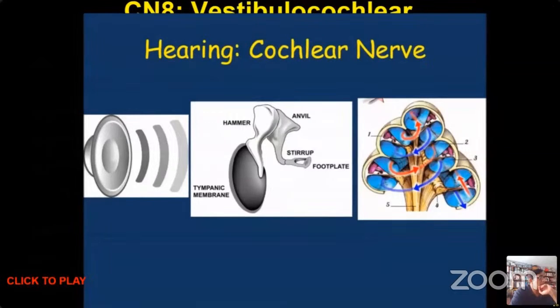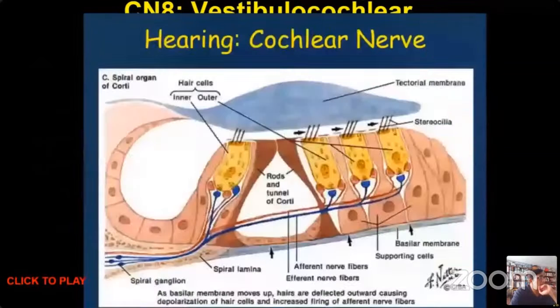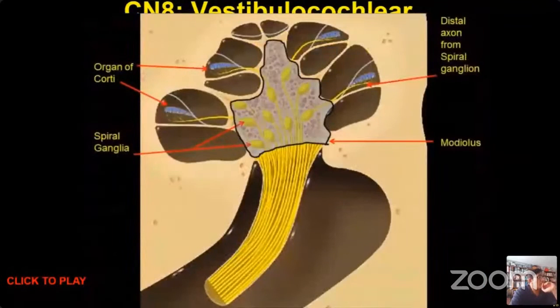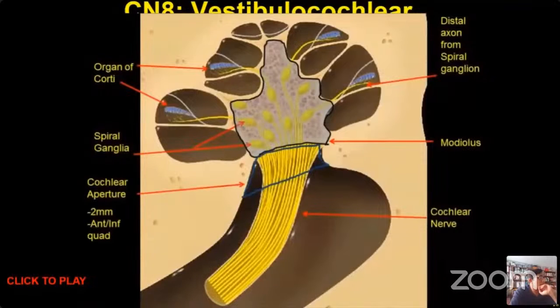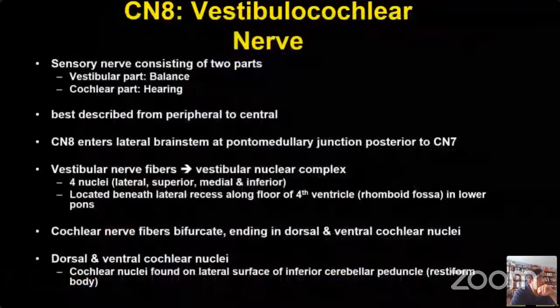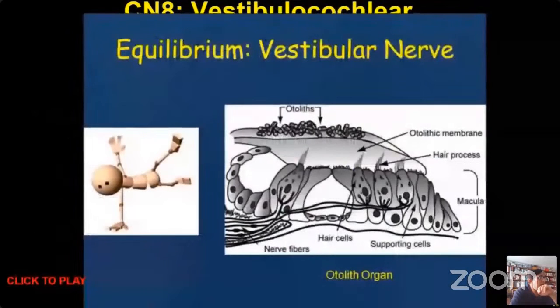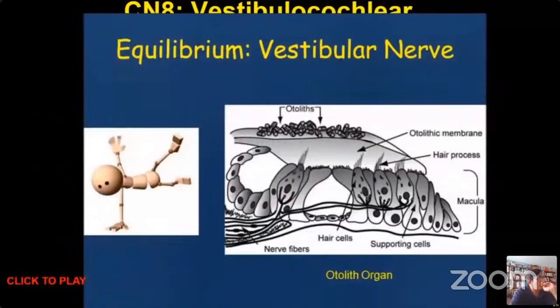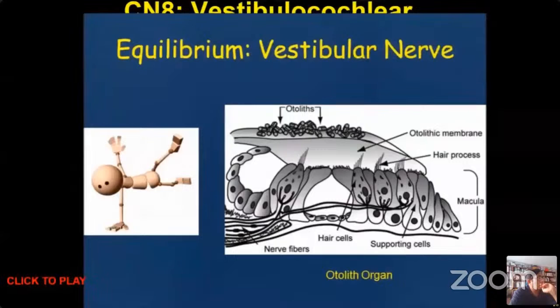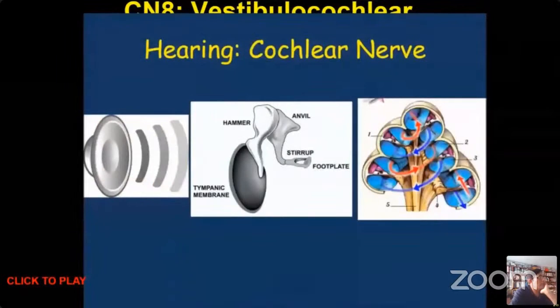So I'm going to click on this, and you should be able to see. So this actually is the organ of Corti. That's modiolus. That's a cochlear nerve. So when I'm speaking to you, the whole thing is coursing through that. So let me try to do that again. Oh, it doesn't want to go back. I think we can. Okay, so let's start all over.